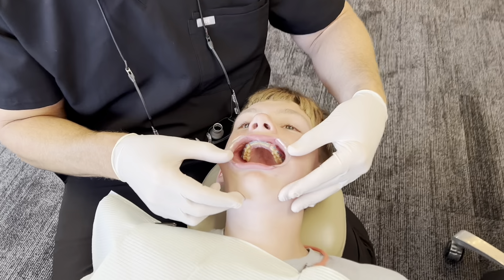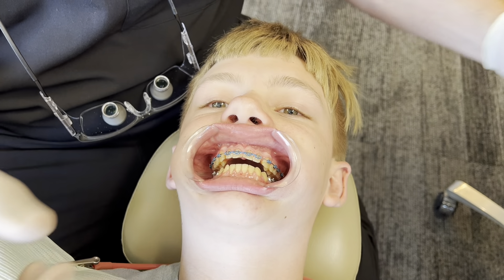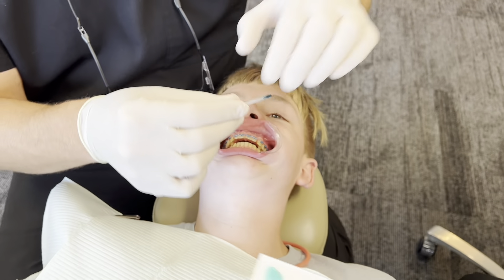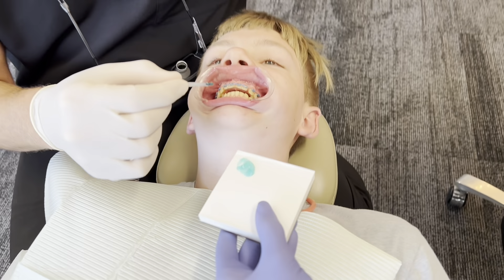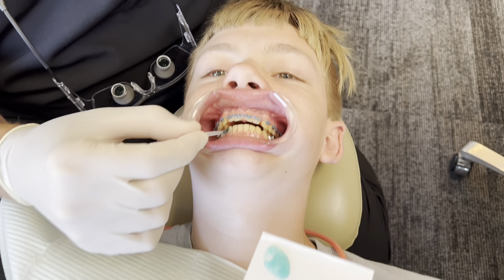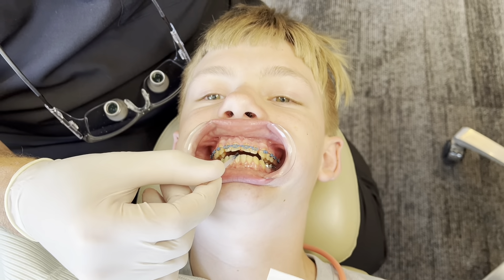This is the fun part everybody's waiting to see. Yeah, go ahead and bite down for me a little bit. There you go, perfect. So same process, you remember right? Is that glue? Nope, this is the etch that cleans the teeth off.